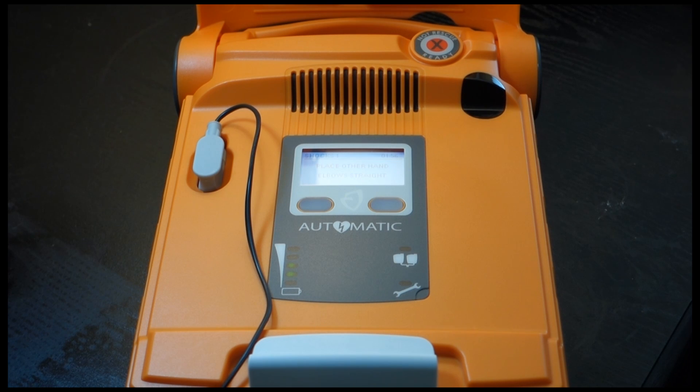Lean over the patient with elbows straight. Press the patient's chest down rapidly, one third the depth of the chest, then release. Start CPR.